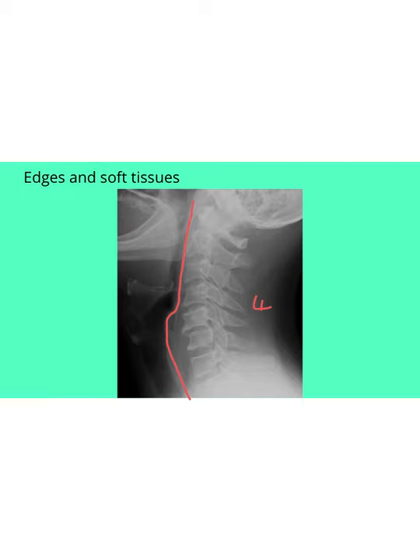In conclusion, what do we see on this x-ray? We see a unilateral perched facet subluxation at the level of C5 and C6. You can see that this facet is perched on top of the one below it, and any further anterior movement of C5 would cause it to dislocate completely.